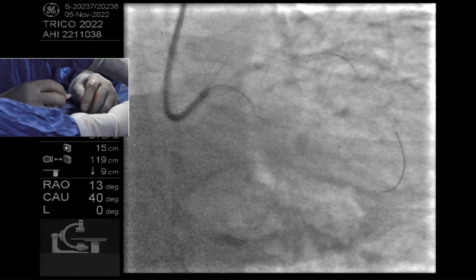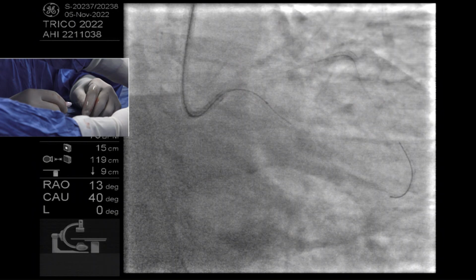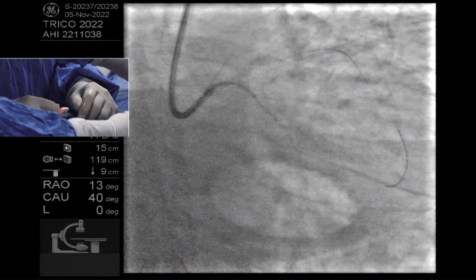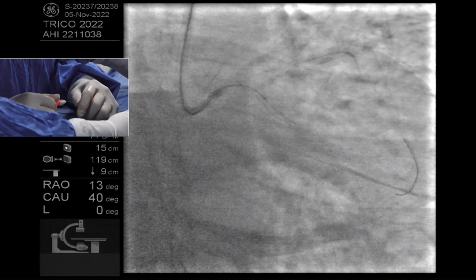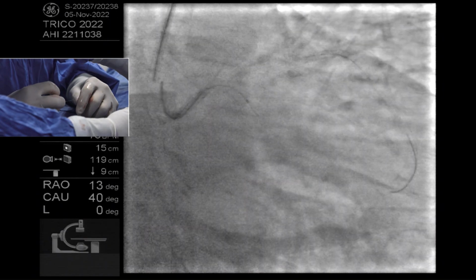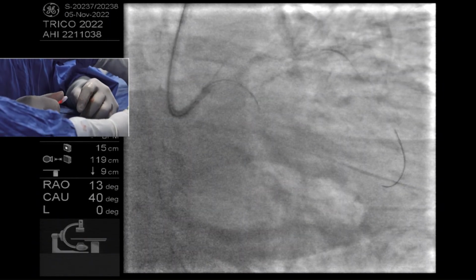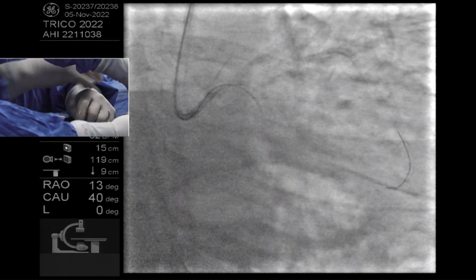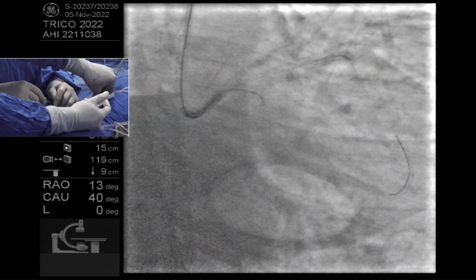Normally, the Japanese masters say that for the shaping of the Gaia you don't have to do a double bend on it, but in this case maybe this could be necessary to get it engaged. There you go. I think that might help.